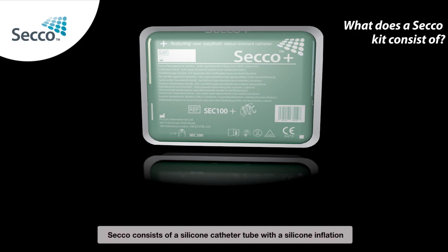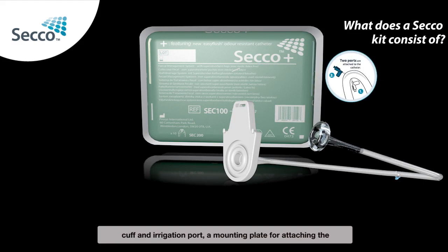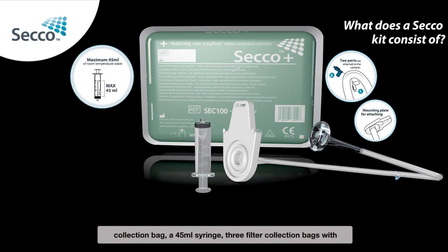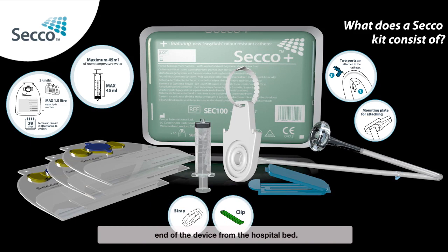Secco consists of a silicone catheter tube with a silicone inflation cuff, an irrigation port, a mounting plate for attaching the collection bag, a 45ml syringe, 3 filter collection bags with 1.5 litre capacity containing a superabsorbent pad, an odour control apparatus, and a clip and attachment strap for hanging the lower end of the device from the hospital bed.